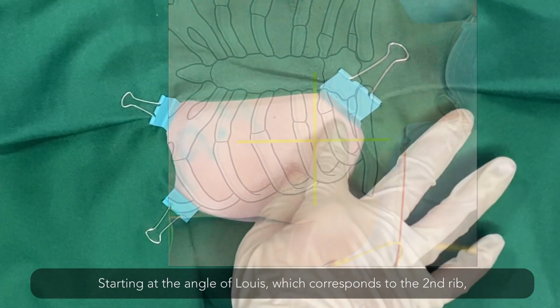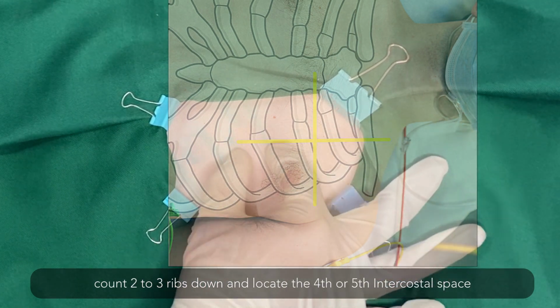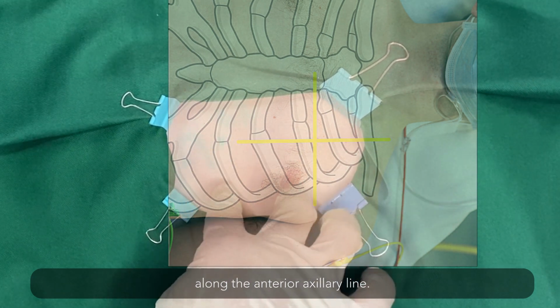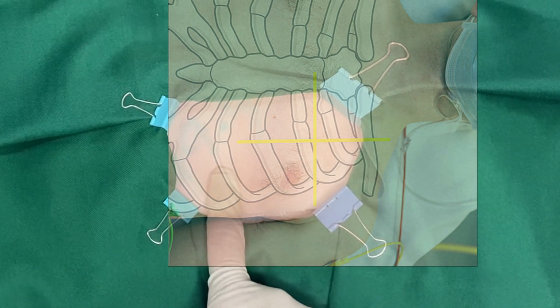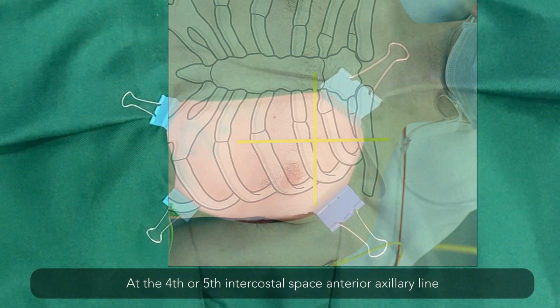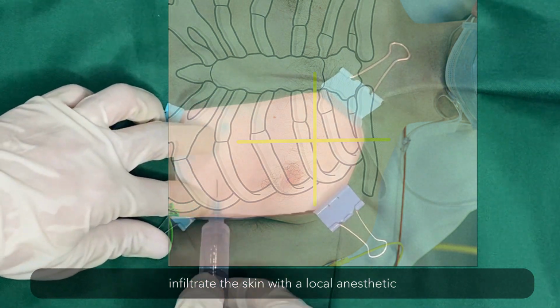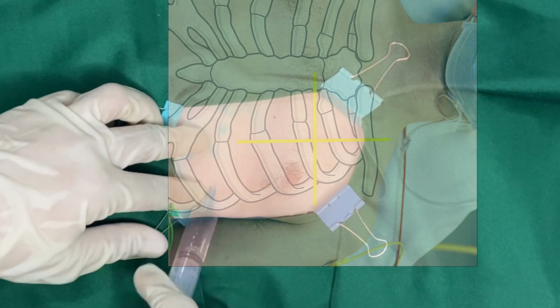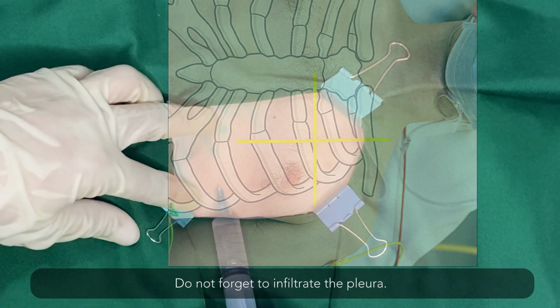Starting at the angle of Louis, which corresponds to the second rib, count 2 to 3 ribs down and locate the 4th or 5th intercostal space along the anterior axillary line. At the 4th or 5th intercostal space, anterior axillary line, infiltrate the skin with a local anesthetic and block the intercostal nerve branches. Do not forget to infiltrate the pleura.